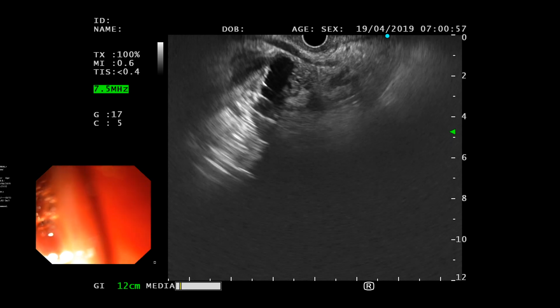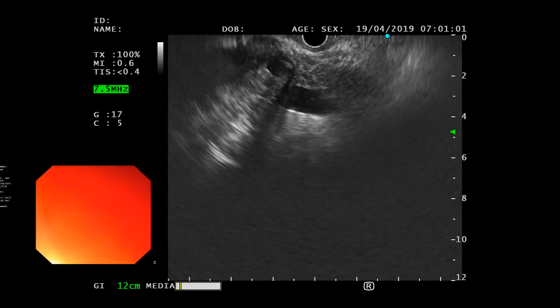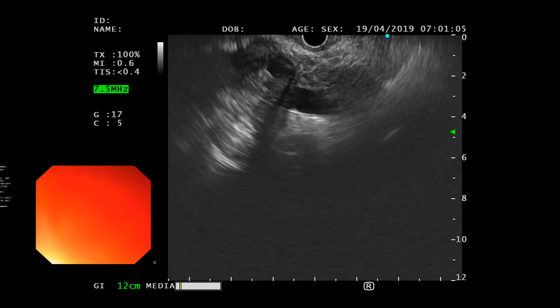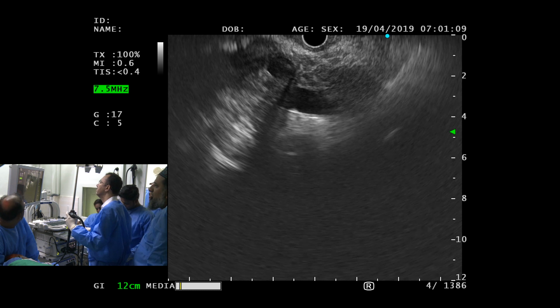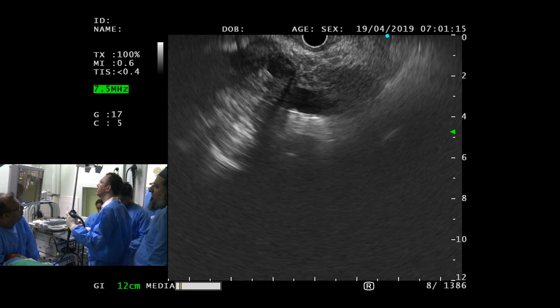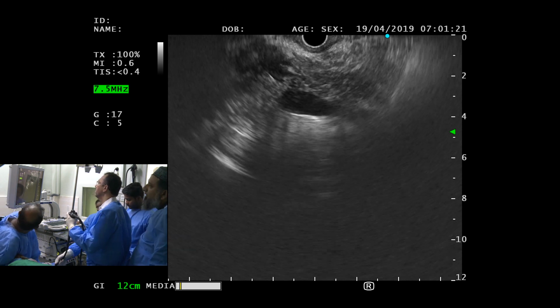हाँ जी, क्या देखते हैं बताइए. I thought there was a PT stone with the shadow here. Can you stop here? Can you freeze the image here? Yeah. So now can you see there is a stone here? There is a stone here. Yeah. Where is the stone? Can you just move the image a little bit? फ्रीज हुआ हुआ तो बस, yeah.